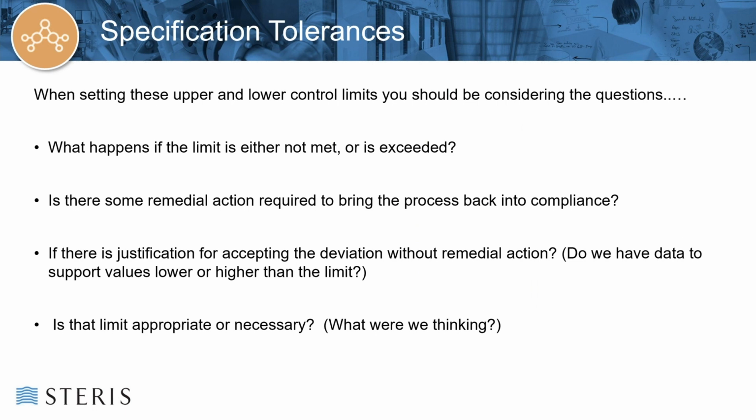In doing all of that, a failure mode analysis is usually a good way to analyze your data. So the set point of the process does not need to be central to the upper and lower control limit. It should take into account the most likely failure mode that could push the parameter beyond its limits. So, for example, if we use exposure time again, and based on all of the data that we did from our sublethals and our MPQ, etc., we need the set point to be 360 minutes.